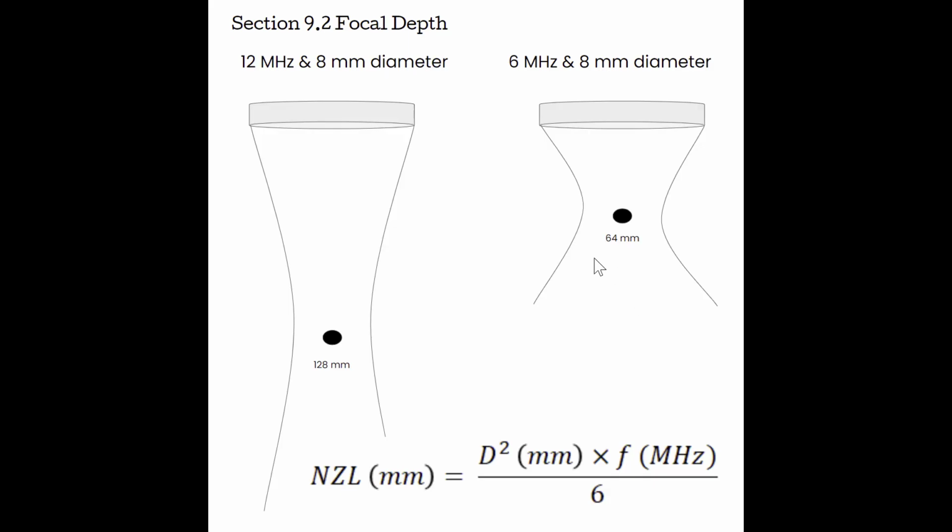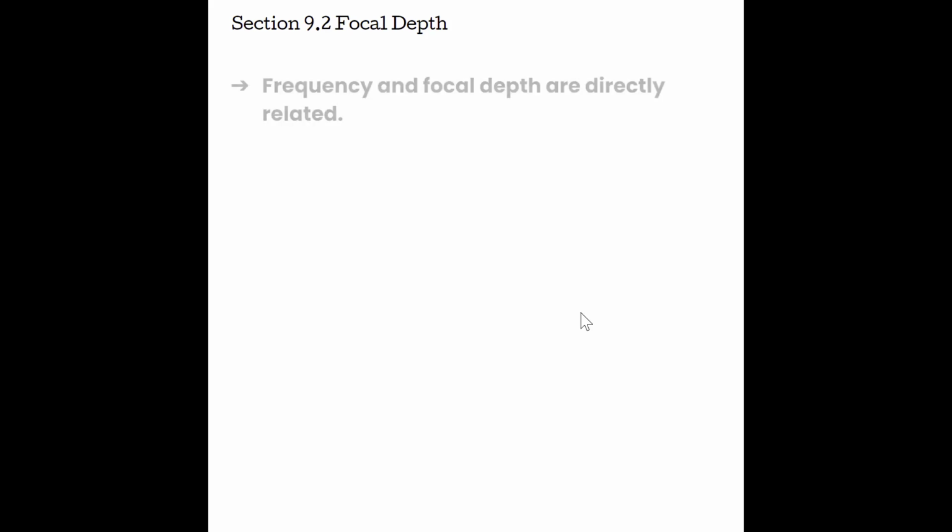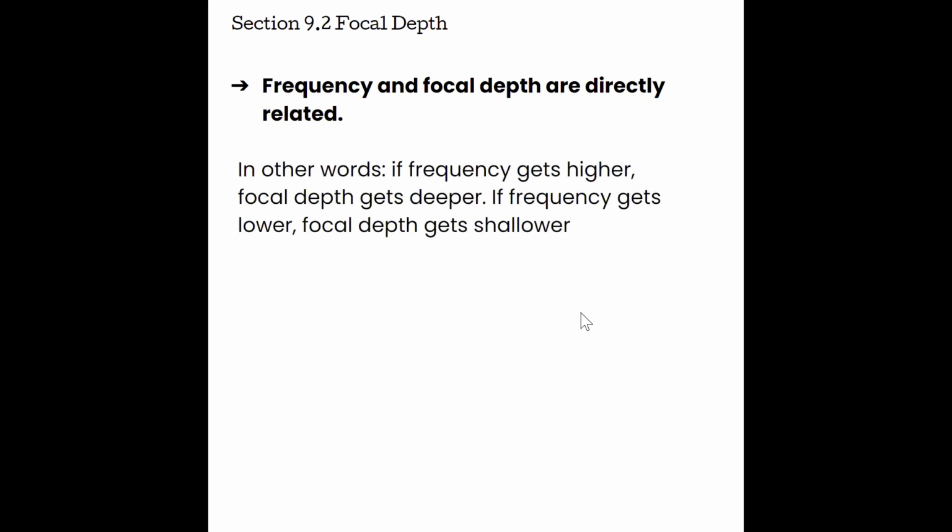So by using those numbers and using our formula, we get to see one of our first relationships in action. We can now see that frequency and focal depth are directly related. So in other words, as frequency gets higher, our focal depth gets deeper.